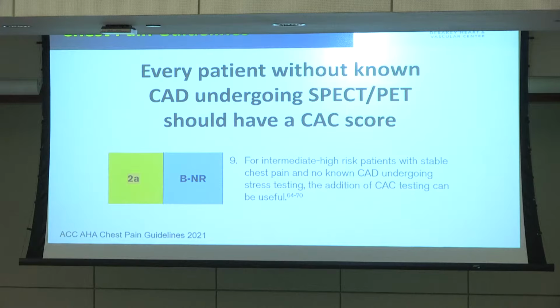It makes sense. Obviously, there is no randomized data on whether you got calcium versus no calcium, but there are at least about 8 to 10 cohort studies that I'm aware of, between SPECT and PET imaging, that show that by adding calcium score, you enhance the accuracy.